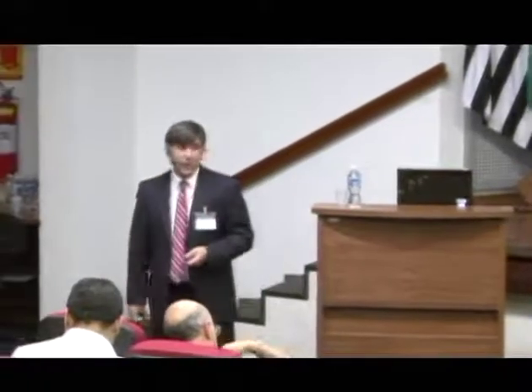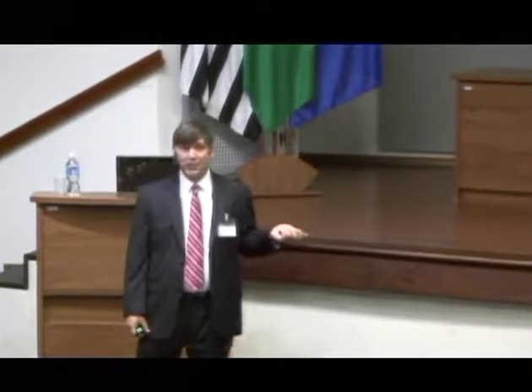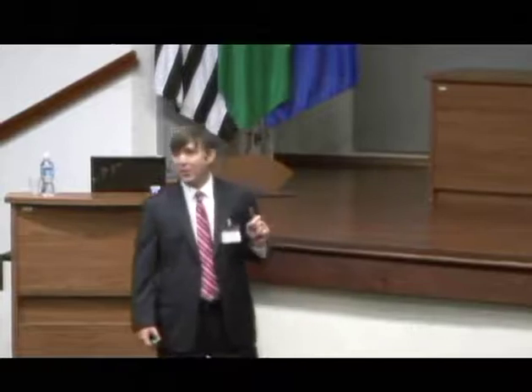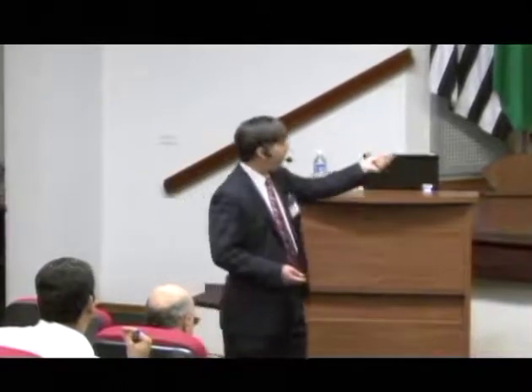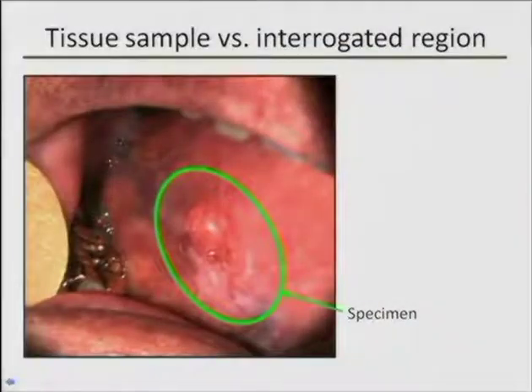And so these things can kind of play havoc with your ability to properly evaluate the diagnostic performance of your instrument. Another thing to keep in mind is that for normal sites or sites in healthy volunteers, you probably are not going to have a histopathology, just because you're probably not going to have biopsies taken from those normal sites. And finally, site correlation is absolutely essential. You have to be very, very certain that your gold standard came from exactly the same location where you did your measurement. And I want to talk about that a little bit more. Let's suppose that you have a surgery taking place and you're going to end up with a surgical specimen that is a fairly large specimen that includes a lesion. And that specimen is going to receive a histopathology diagnosis that is probably going to correspond to the worst thing that they found in that piece of tissue.